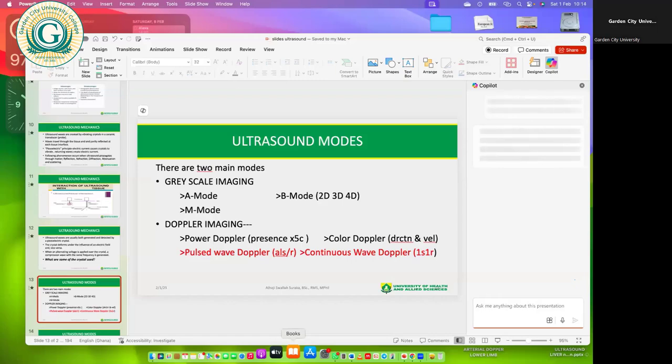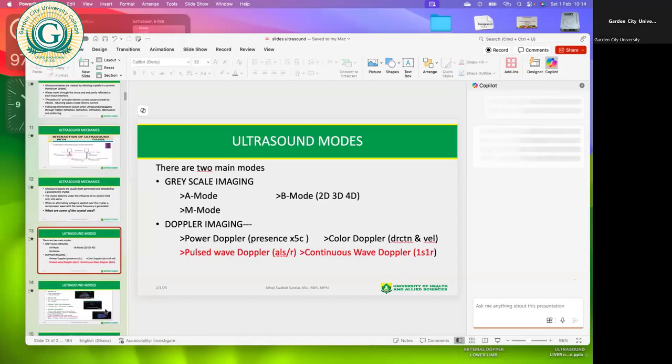If you put color Doppler on that particular uterine artery, there will be a flaring, a notation or an image that would depict to you that there is flow, which is usually denoted in brown for power Doppler. It will be very brown. That particular region you select will appear very brown if there is flow, and blank if there is no flow. There will be no coloring of that particular area.